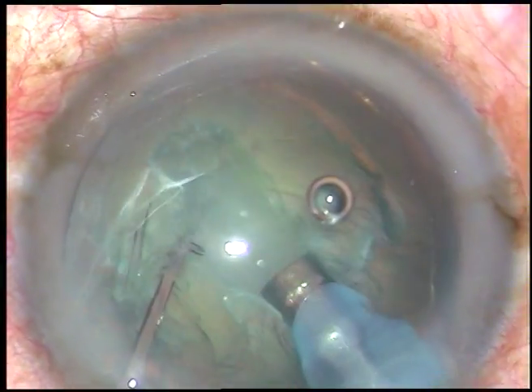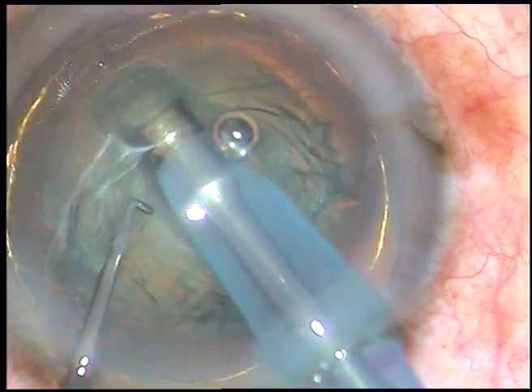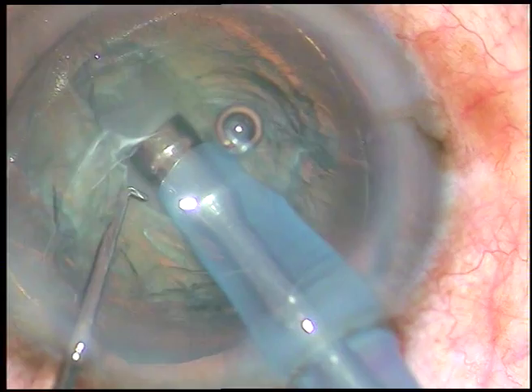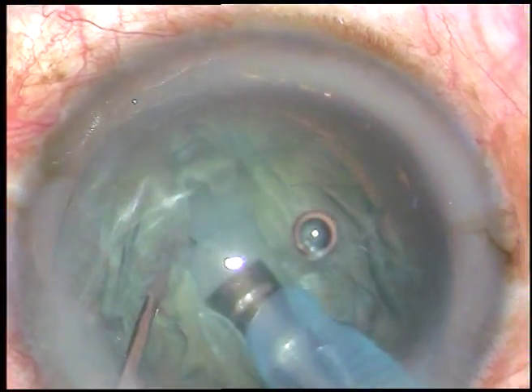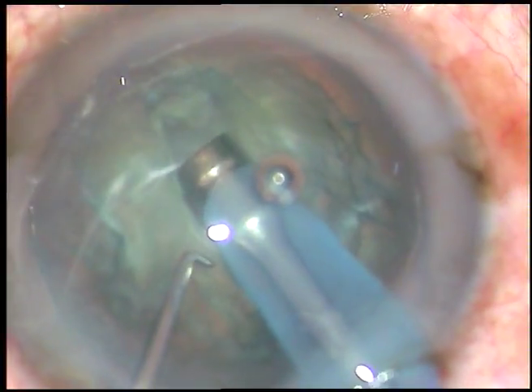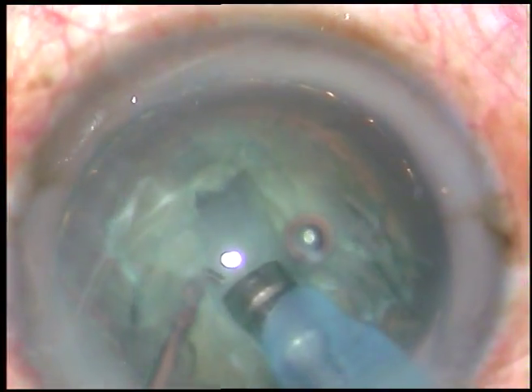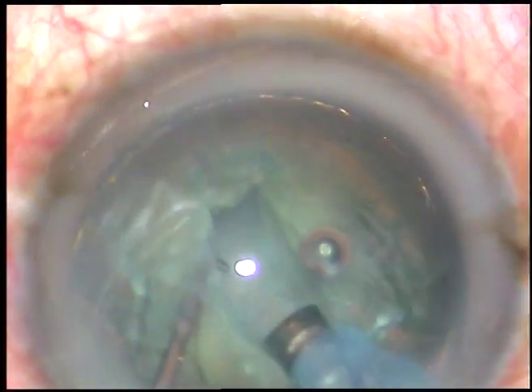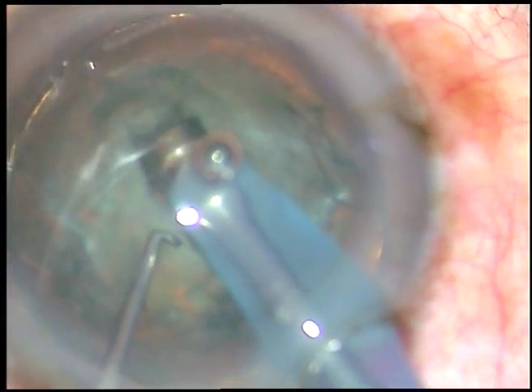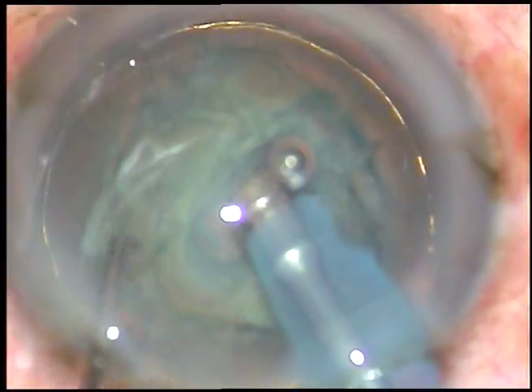Now making a trench — always apply ultrasonic energy when you are going forward and make the central part of the trench deeper than the two ends. The length of this trench is from the rhexis margin on one side to the rhexis margin on the other side.